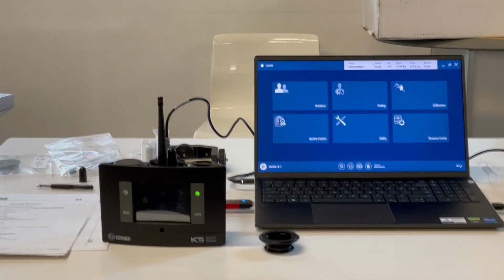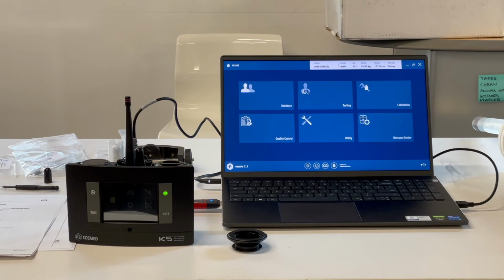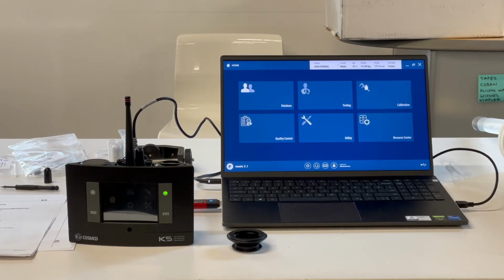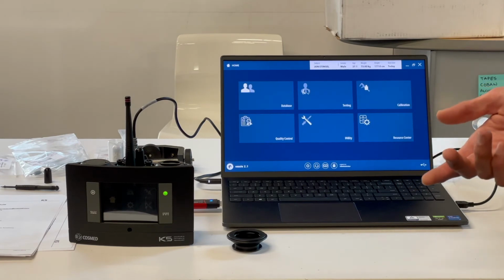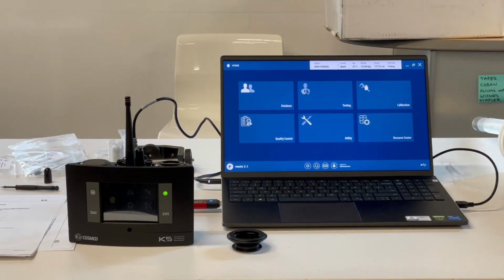There's an arterial blood gas marker, which just says we took an arterial blood gas measure, with no value. Or you drop a standard marker that you can label whatever you want. I didn't know that, so that's cool.